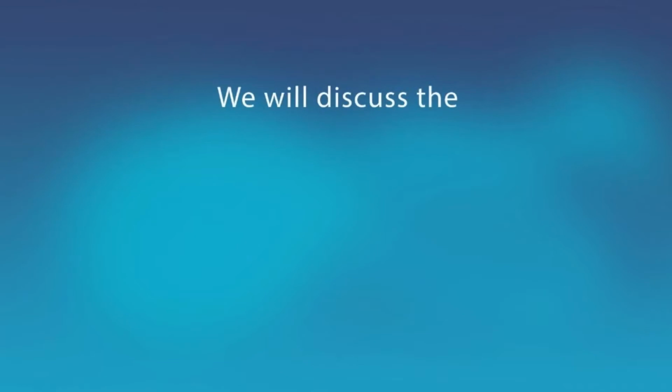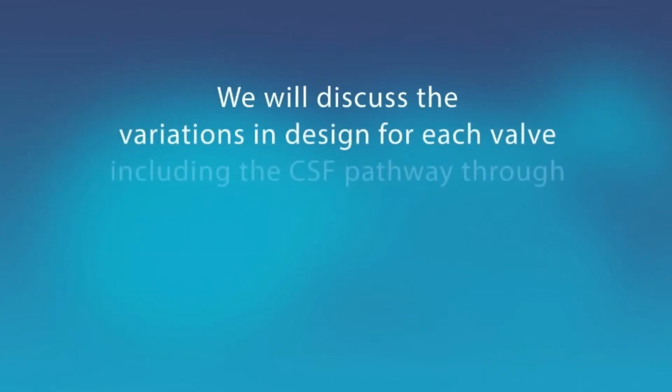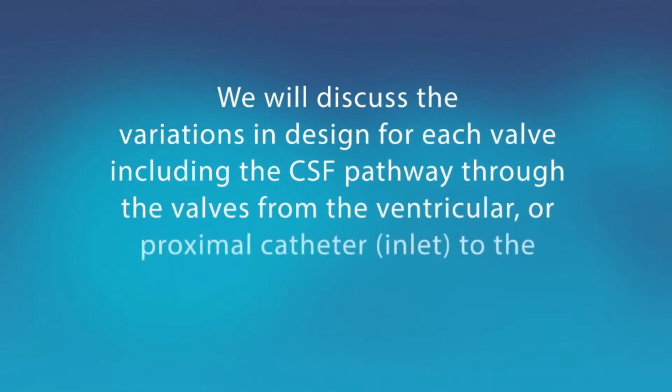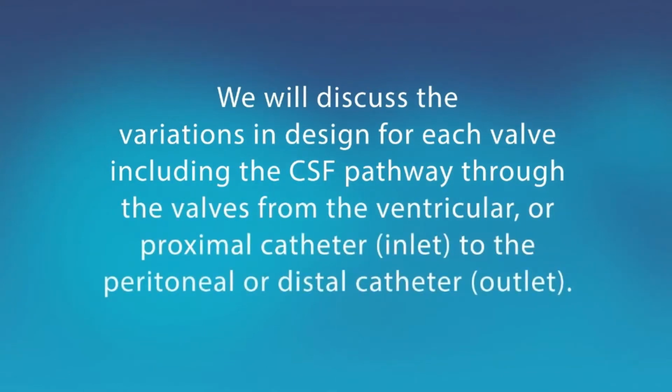We will discuss the variations in design for each valve, including the CSF pathway through the valves, from the ventricular or proximal catheter inlet to the peritoneal or distal catheter outlet.